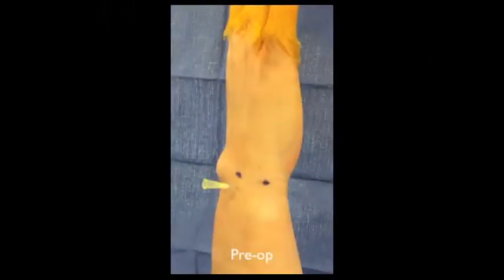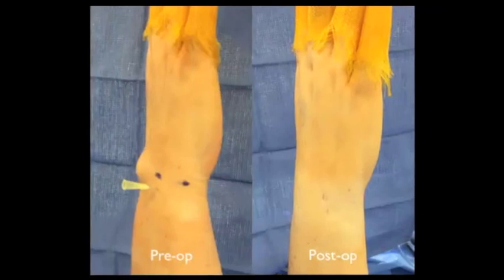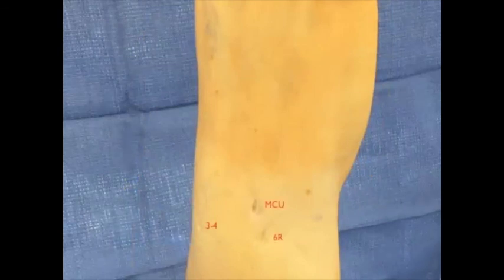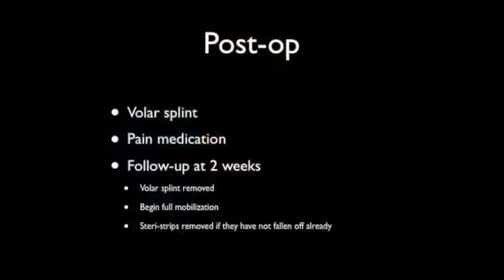At conclusion of the procedure, all port sites are closed with 4-0 monocryl in interrupted inverted deep dermal fashion. Mastisol and steri-strips are then applied. The patient is placed in a volar splint to allow the wrist to rest and any inflammation to subside. This also prevents the pumping action of joint motion, which has been suggested as a mechanism for formation of synovial cutaneous fistulae. The splint is removed at two weeks and mobilization is commenced.